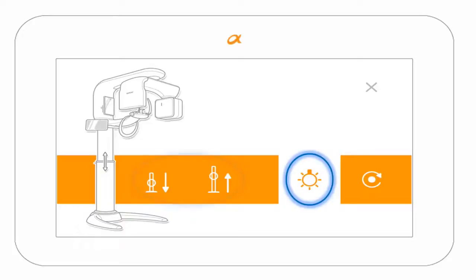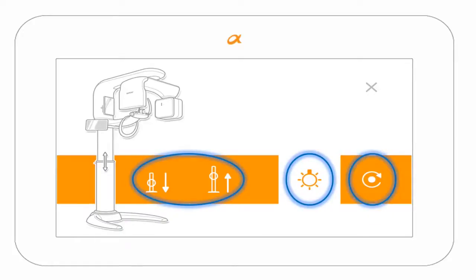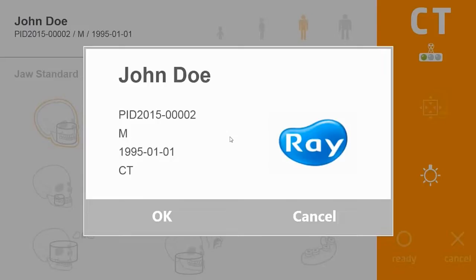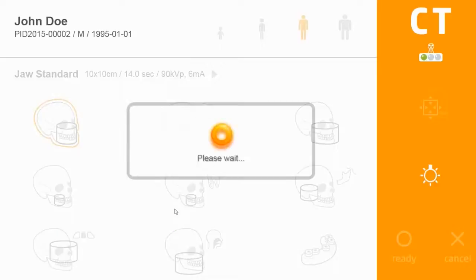The touchscreen selections include laser alignment lights, up and down buttons, and the reset button. Set up the acquisition from within your imaging software. The first screen shows patient information including name and ID number.